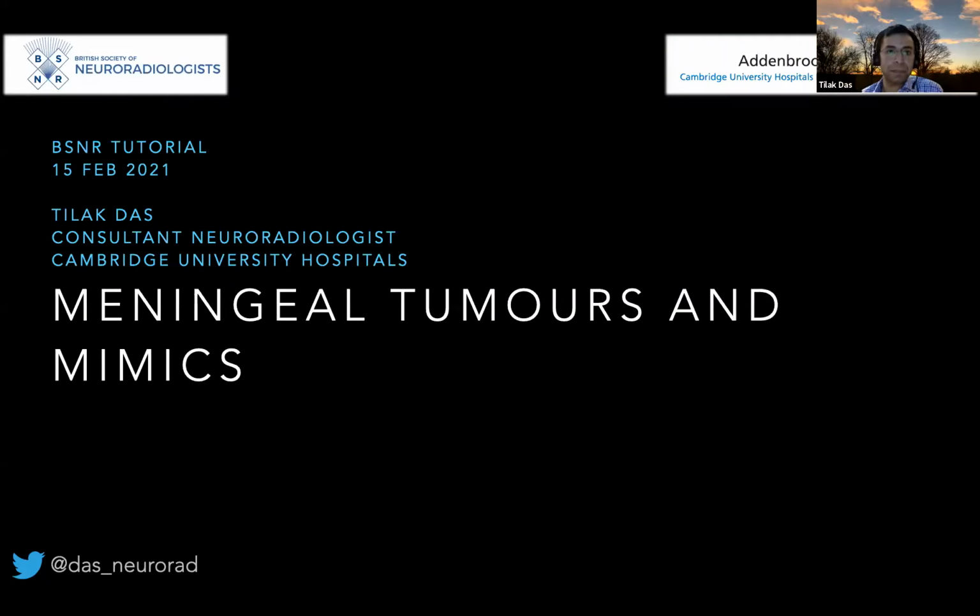In the Q&A, someone has asked regarding follow-up of meningiomas, what's the role of giving contrast? Can you use non-contrast studies for follow-ups? So I presume you're talking about meningiomas that have not been operated on. Post-surgical, of course, you would give contrast. We do it sometimes when there's some relative contraindication to contrast, and you're not particularly keen to do it. I think we'll accept that, but as a general rule, I would do post-contrast studies.